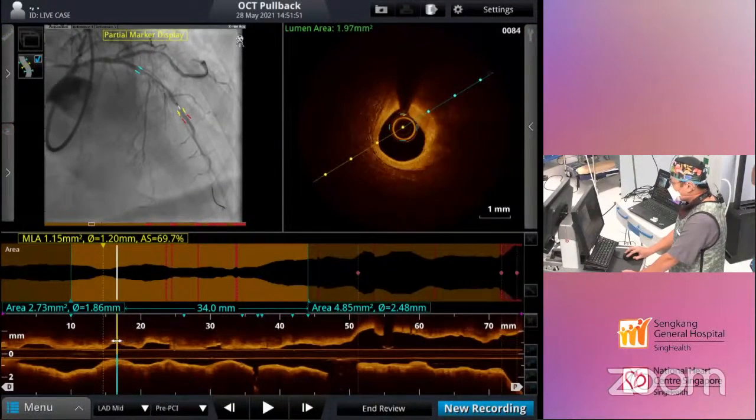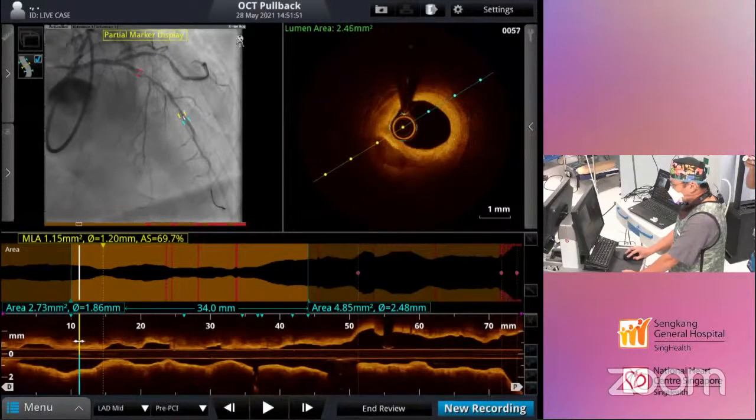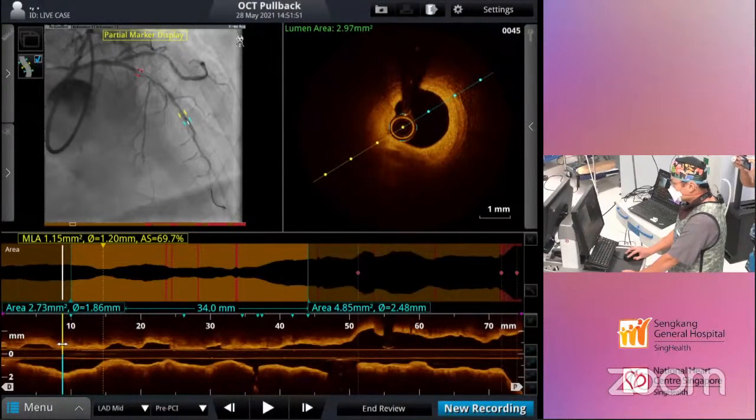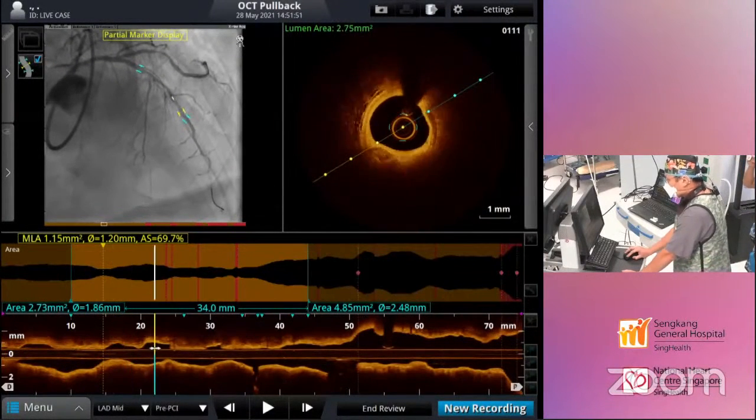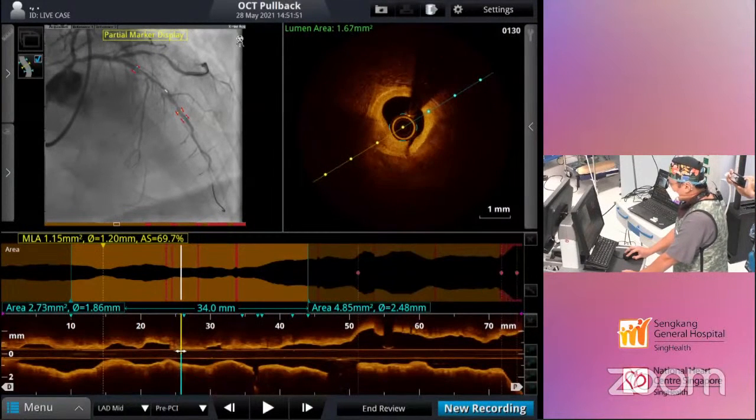And another tight spot down here. And then this is probably as normal as we can get in order to land our distal edge. So to further assess the degree of calcification, of course, we all know about the OCT calcium scoring system.